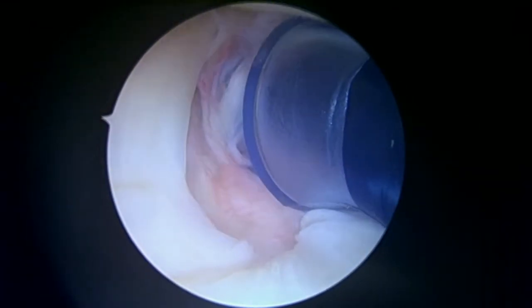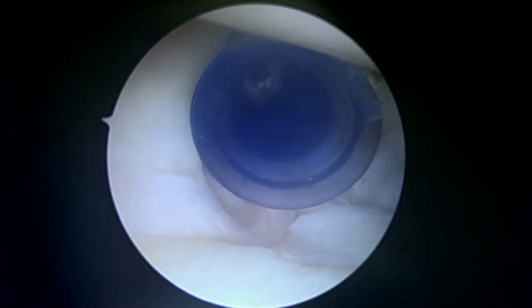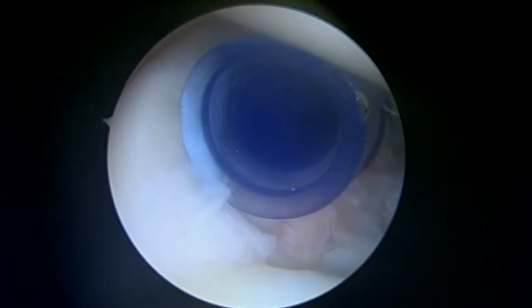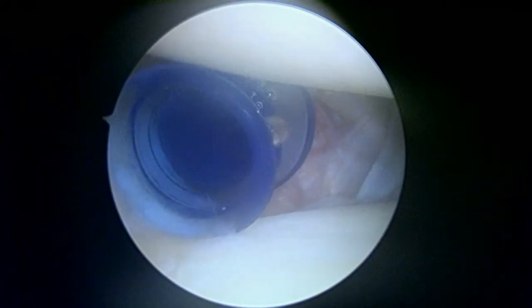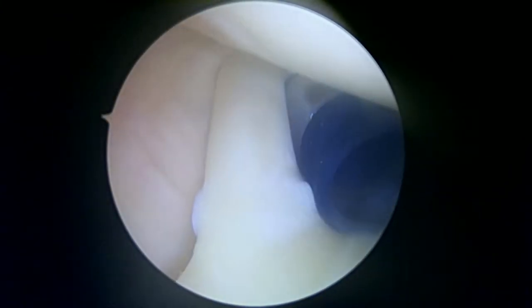This is the look with you laying on your side. The camera's coming in the back of your shoulder. That blue cannula you see is coming in the front. To the left of the blue cannula, that's the biceps tendon, the long head of the biceps tendon. Down below here is the biceps anchor, and you can see you've got a little split in it. I'm gonna put a shaver there, make sure it's not unstable.